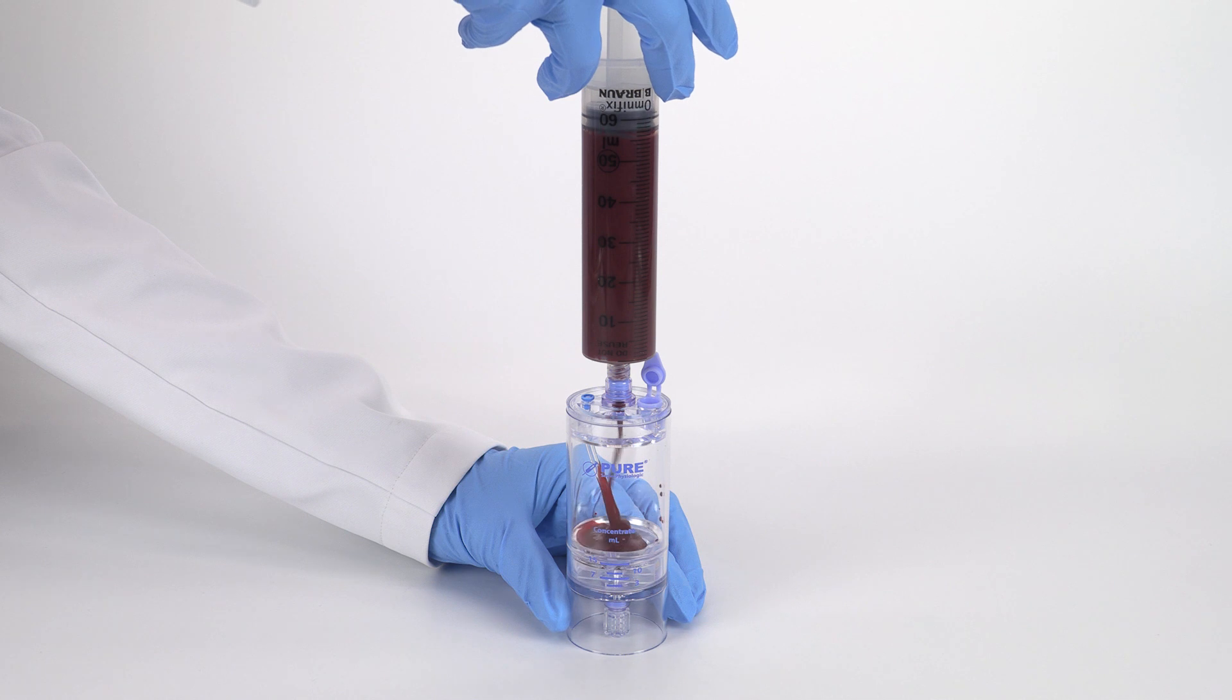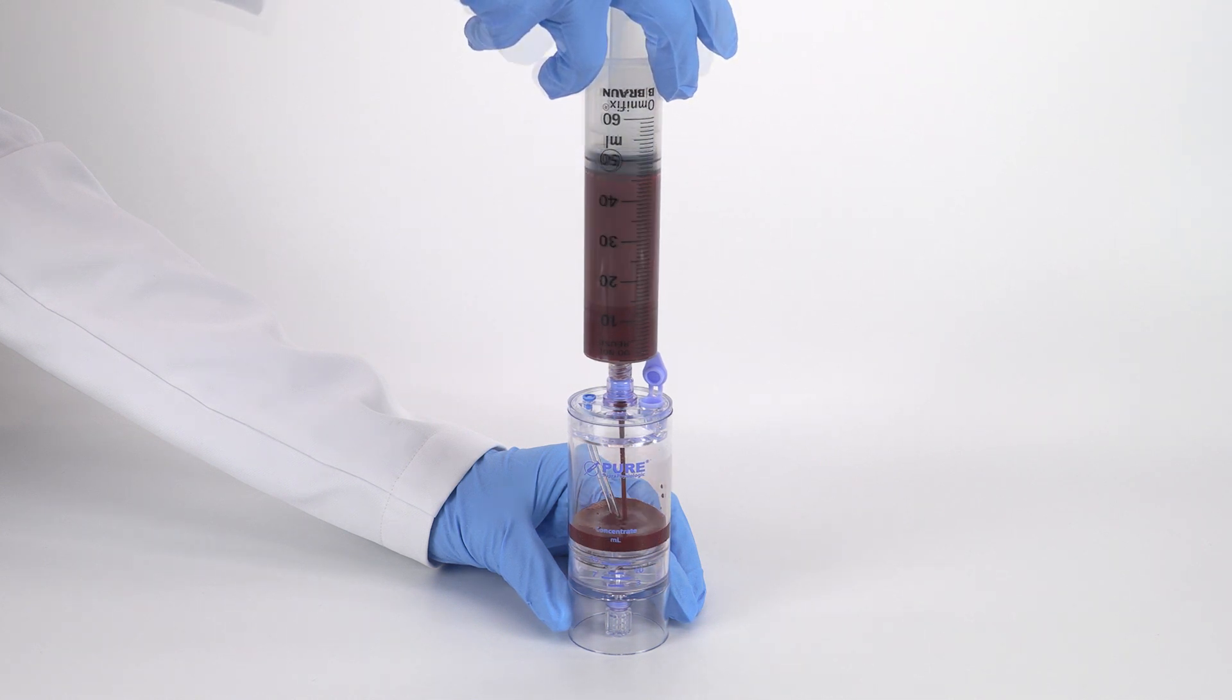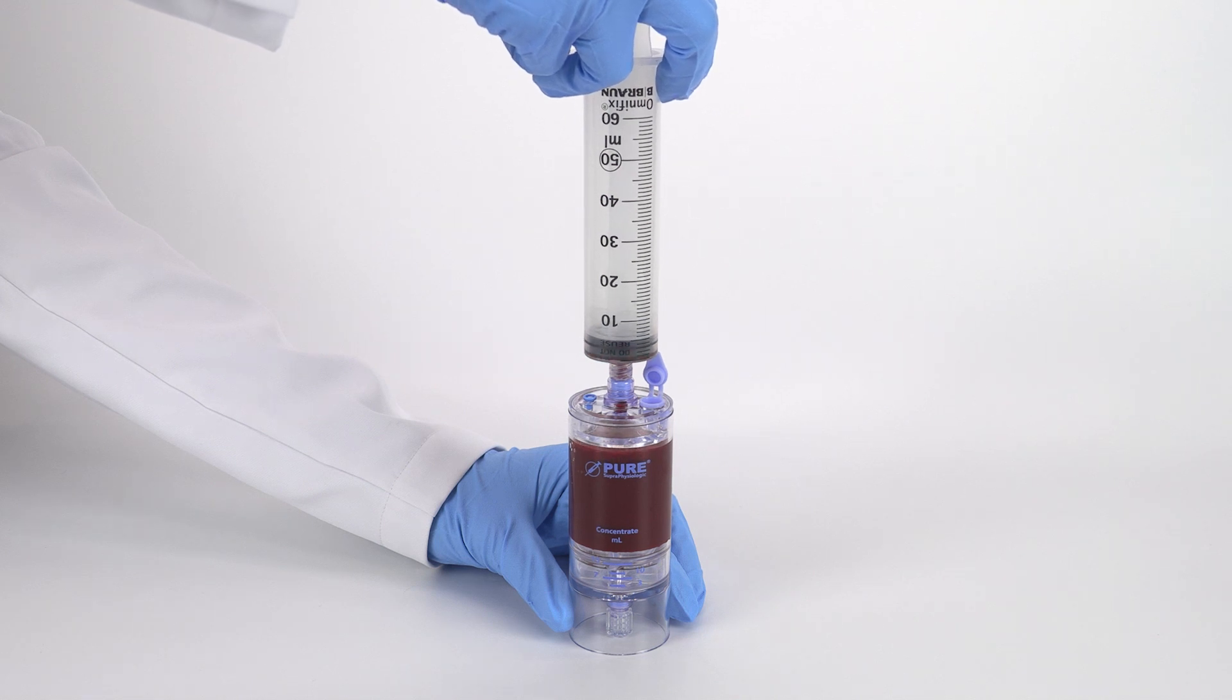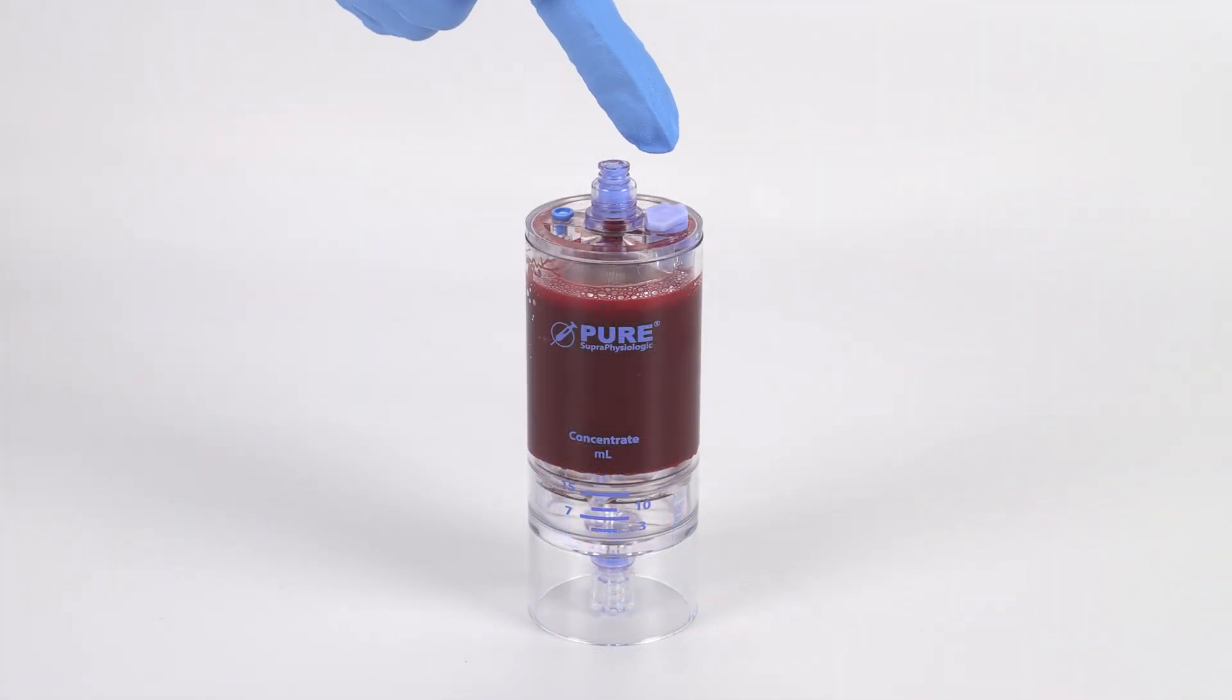Attach the 60 milliliter blood syringe to the top port of the device. Slowly inject the anticoagulated blood into the device. When completed, close the vent.